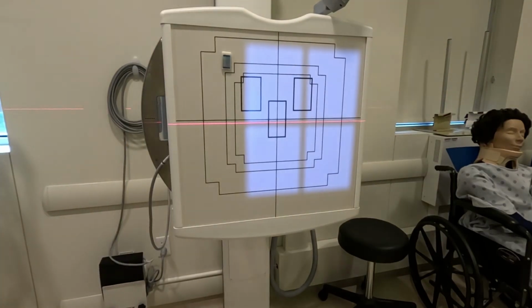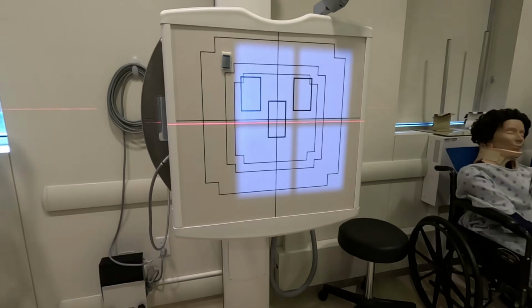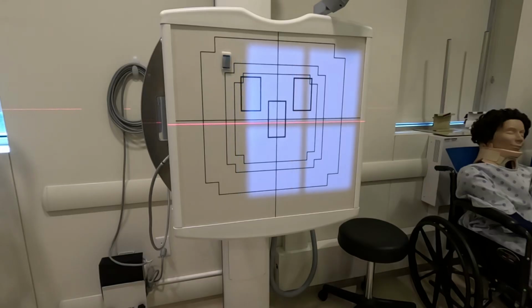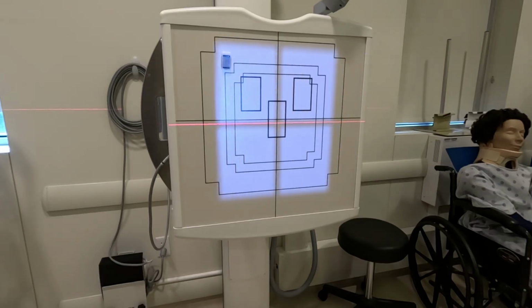So what I need to do is take our x-ray tube, and this was the orange button, and line it up. We should have a detent there too. For whatever reason, it's not locking in. Let me try it again. There it goes. All right, so you get the audible.